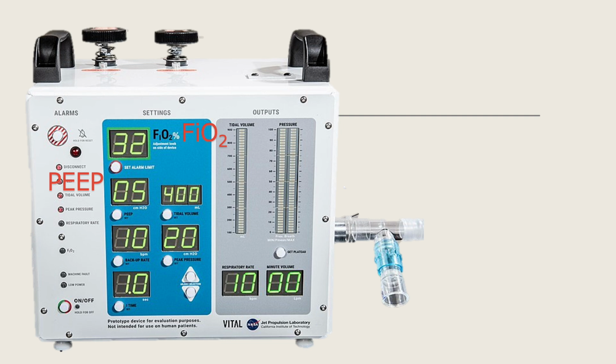And we like to keep a balance of 5 centimeter water pressure in order to keep them open, but at the same time prevent pneumothorax. We don't want them to be at very high pressure. So how much oxygen and how much pressure determines the oxygenation. Okay, so this should be enough to deliver proper oxygen.